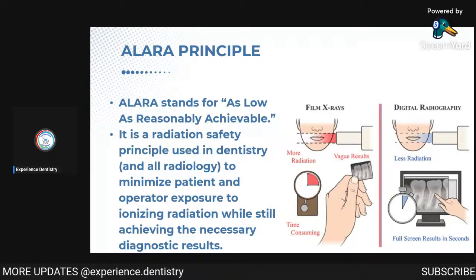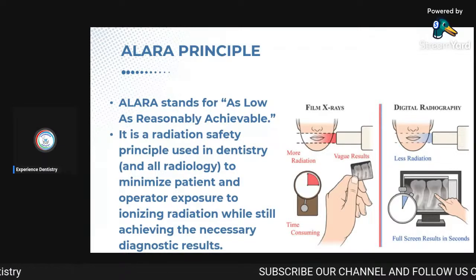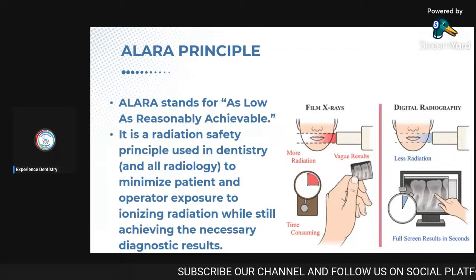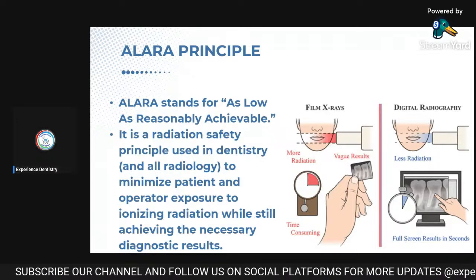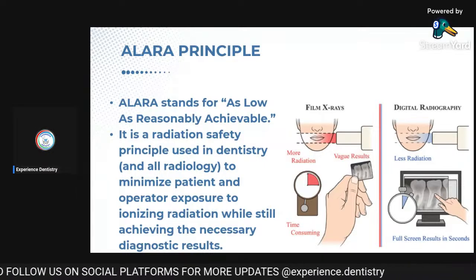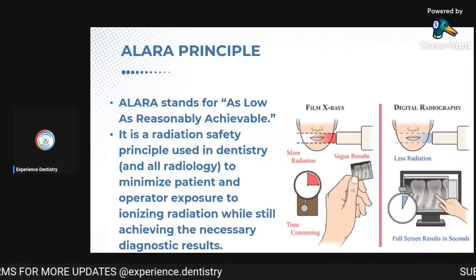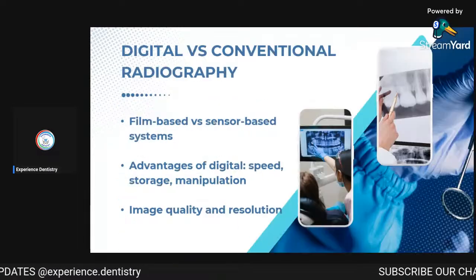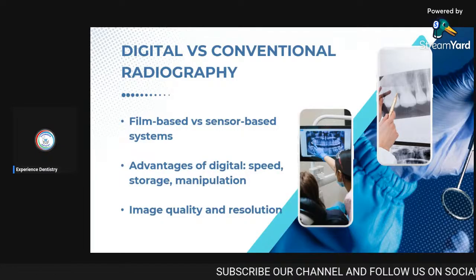In the old time, you had to prepare the film, then you had to wash it in the solution, then the results came, and then you could see your radiograph. However, now you just need to make a click and the picture of the X-ray appears in front of you on your laptop, on your digital phones and cameras, etc. Okay, so this is basically digital versus conventional radiography.